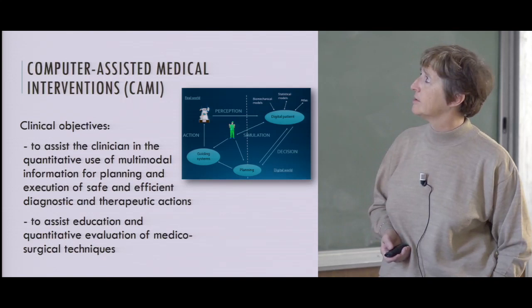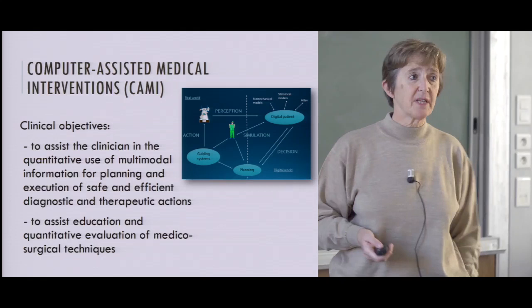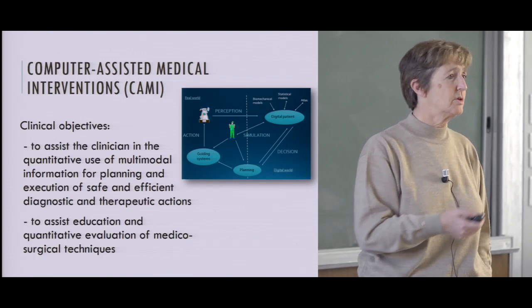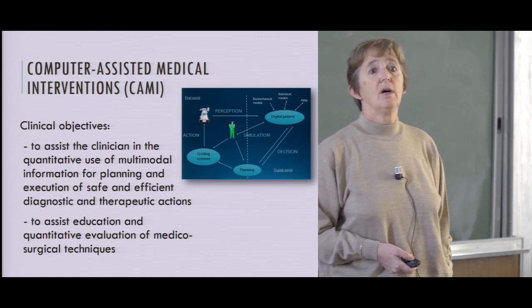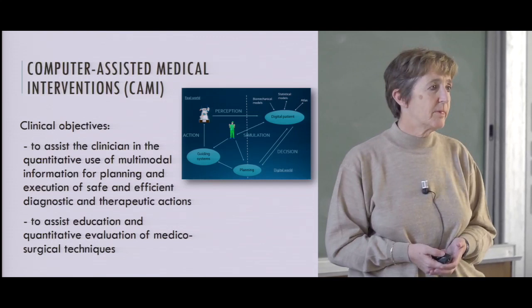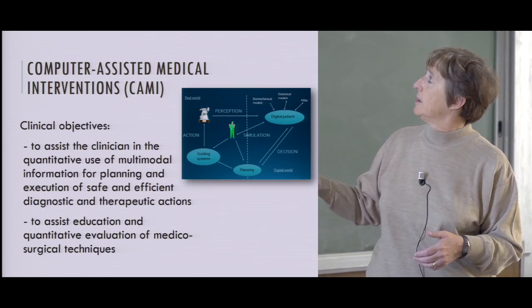And this is to be used for planning some intervention. So you will see it may be more or less automatic. For radiotherapy treatment, for instance, the problem is to deliver a certain dose of X-ray radiation to a certain region of the body of a patient. And at the same time, you want to restrict as much as possible the dose delivery to other regions or organs at risk. So it's kind of an optimization problem that you can solve automatically, but sometimes you need some simulation, you need some biomechanical model to make the planning, and so that involves many components here.